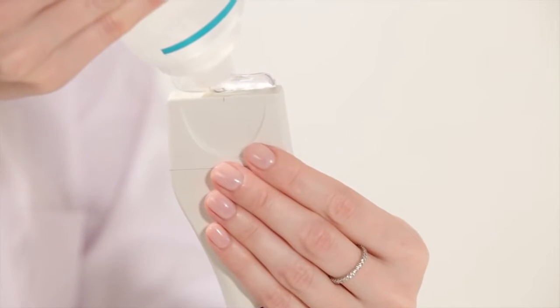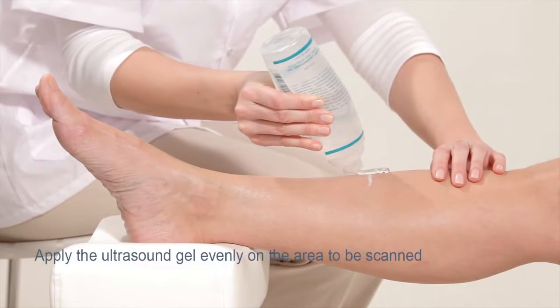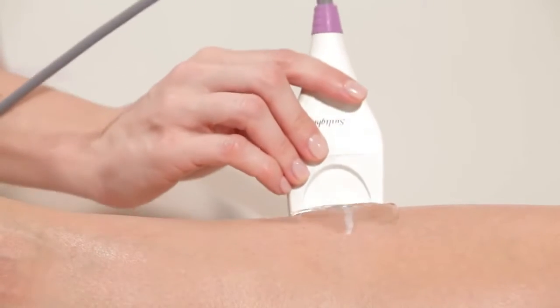Apply a uniform layer of ultrasound gel on the probe and on the leg over the full area of the line. You are now ready to start measurement.